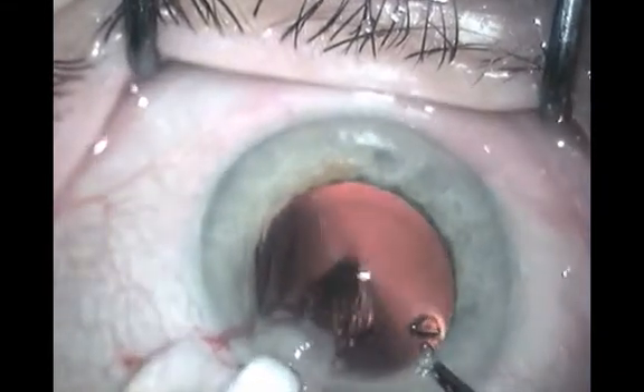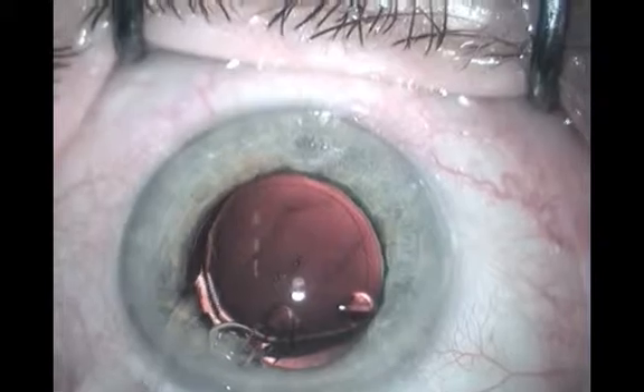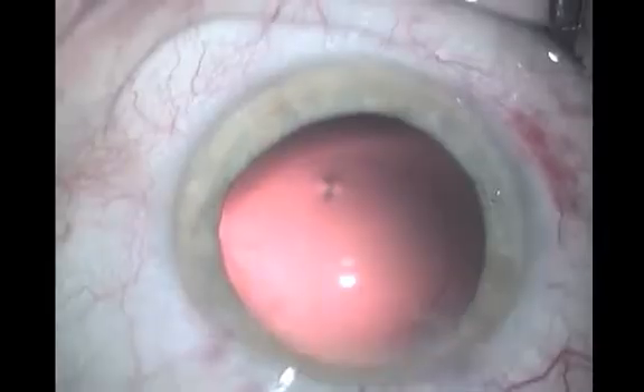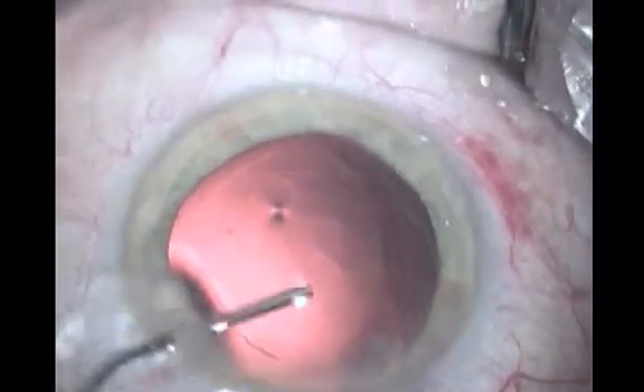In these cases, one may want to place the haptics in an exact position or simply prevent any need to rotate the hydrophilic lens. To do this, inject viscoelastic into the bag opening, opening up the portions where the haptics are intended to be placed.